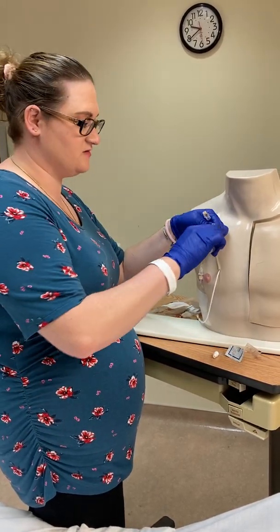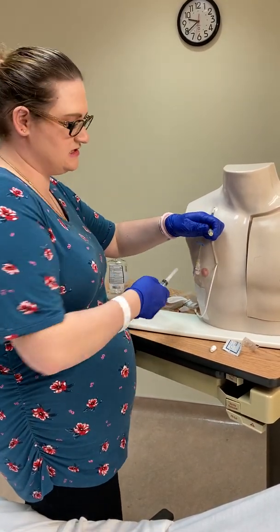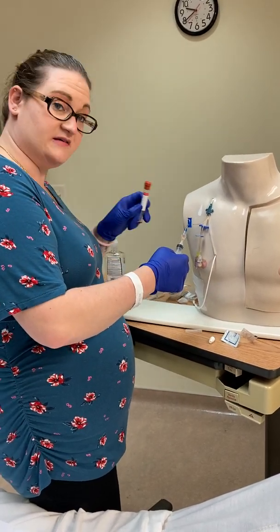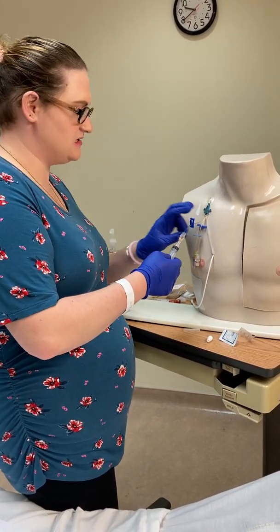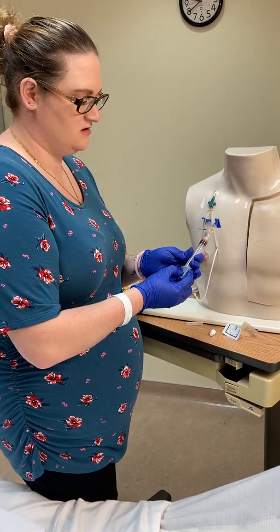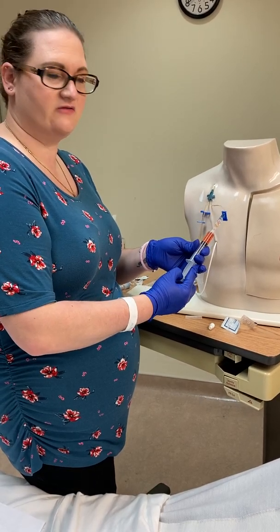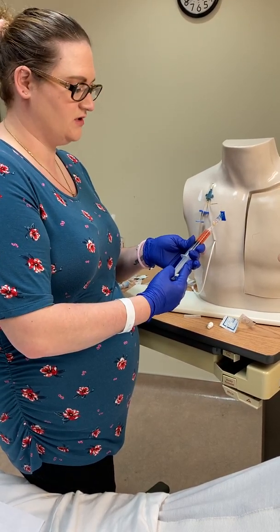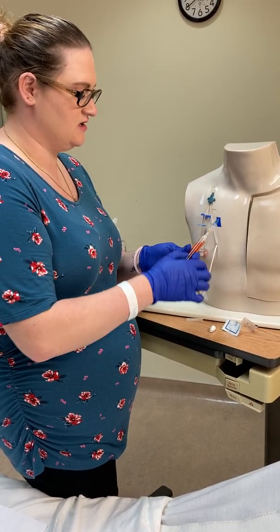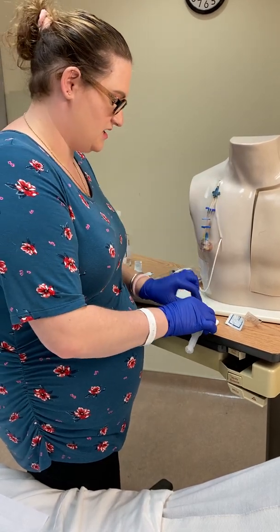Take the empty syringe, attach the blunt cannula, and access the connector. The test tube requires 10 mls, so gently pull back 10 mls. You want a brisk, easy, gentle pull. Do not use excessive force — if you're having difficulty, there's likely something wrong with the line. Once you have the 10 mls, detach.